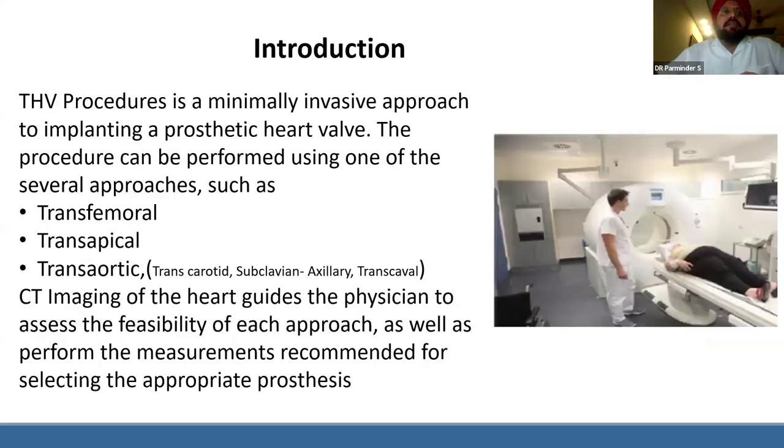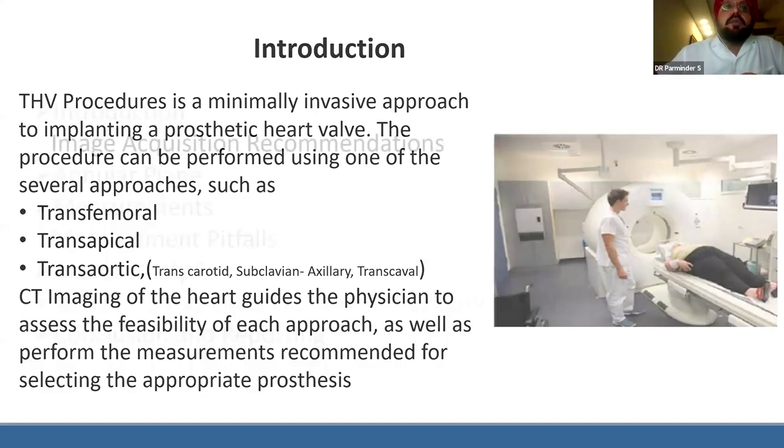So we all know that transcatheter heart valve procedure is a minimally invasive procedure of implanting a prosthetic heart valve. The procedure can be performed using various approaches, most commonly transfemoral. It can also be done transapical, transaortic, transcarotid, subclavian, axillary, or transcaval. CT imaging of the heart guides the physicians to assess the feasibility of each approach, as well as perform the measurements recommended for selecting appropriate prostheses.